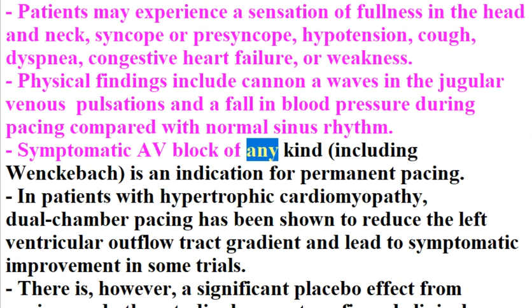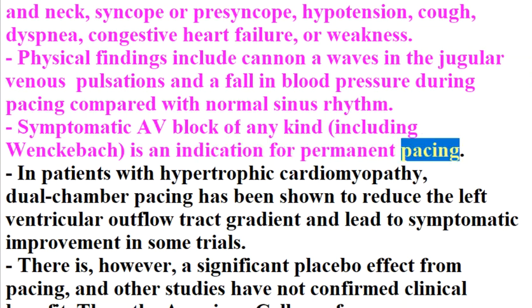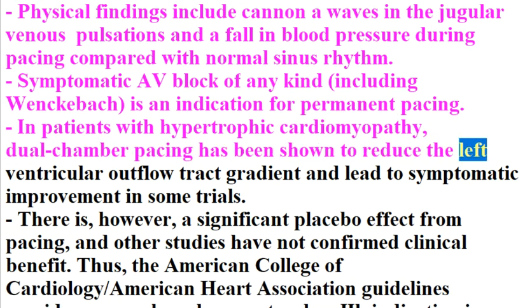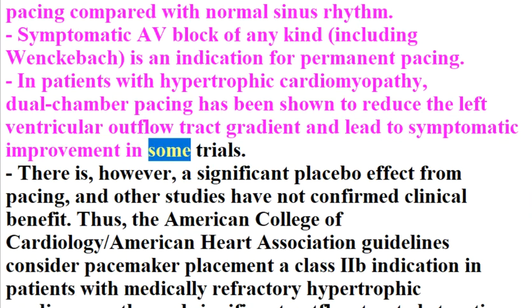Symptomatic AV block of any kind, including Wenckebach, is an indication for permanent pacing. In patients with hypertrophic cardiomyopathy, dual-chamber pacing has been shown to reduce the left ventricular outflow tract gradient and lead to symptomatic improvement in some trials.